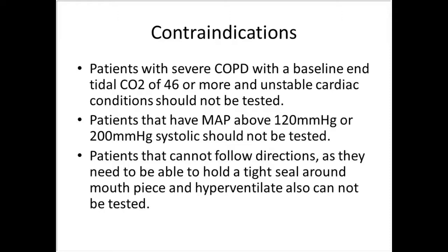So just like a breath-holding exam, patients that can't follow directions, certainly it would be very difficult to test because they need to hold a tight seal with their lips around a mouthpiece, and they need to follow your directions to hyperventilate for the hypocapnia part of the test.